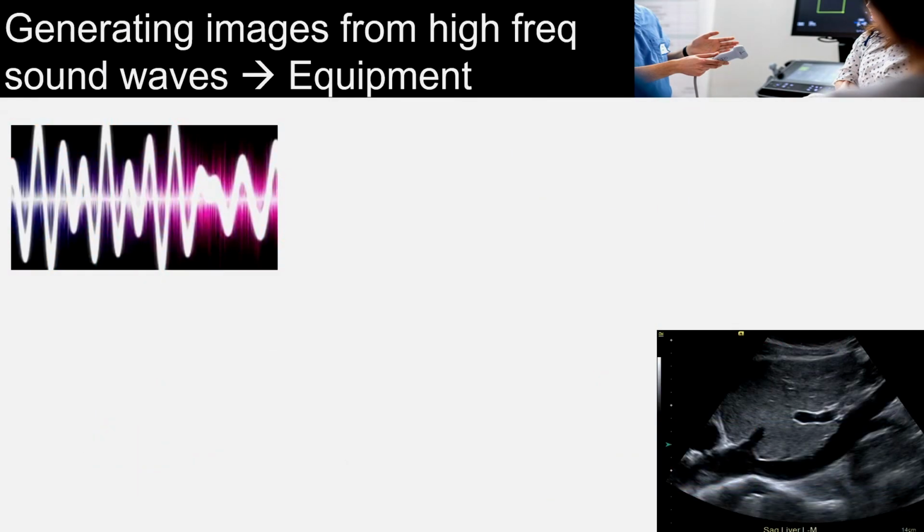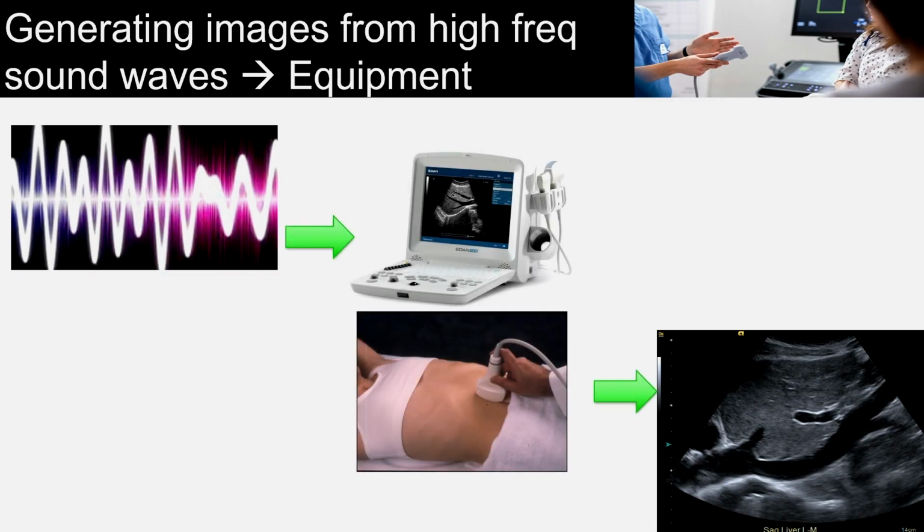All right, well, we've talked about understanding of sound waves. How do we go actually from waves to creating that image? So there's a beautiful interface of having a computer and a transducer that we have to talk about that allows us to take that wave and convert it into that image.